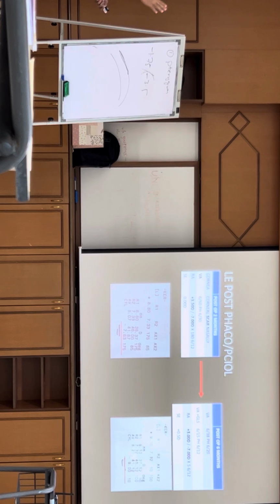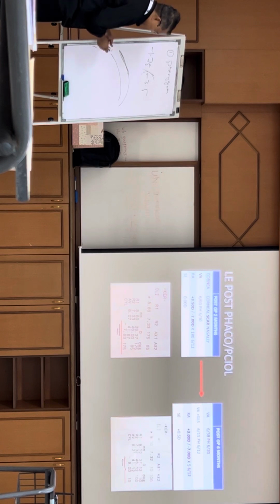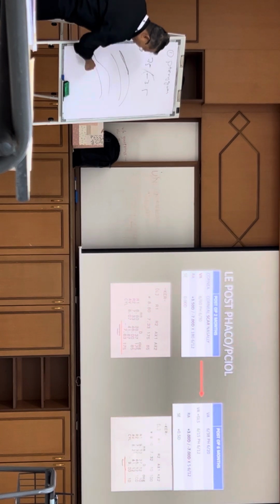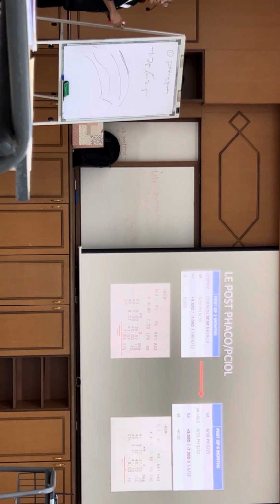If the optometry says that the manual K is consistent, it's not a difficult thing to get, then in that particular part, and there's no thinning. Remember, you must see as well whether there's actually a thinning. Because if you have a thin cornea, you have to know that whatever incision that you do will change your biomechanics. If there's no thinning, it is actually wise to offer the toric IOL.